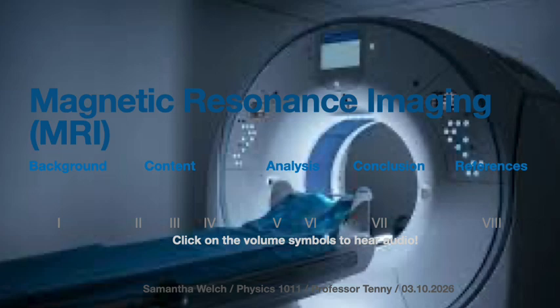In this way, pineapple juice can actually act as a natural contrast agent, improving image quality in the MRCP scan without the need for stronger synthetic contrast materials. This example shows how imaging scientists and clinicians are able to continue to find creative ways to improve MRI image quality while keeping procedures safe and simple for patients.